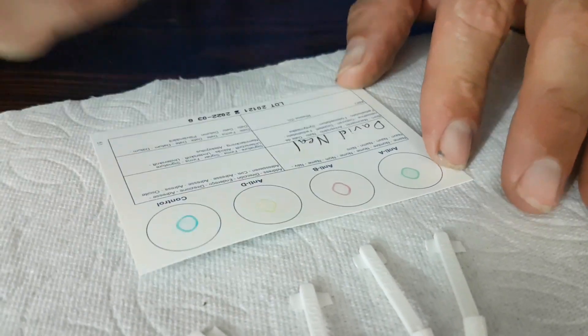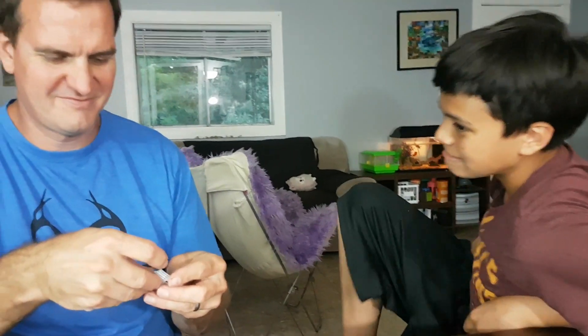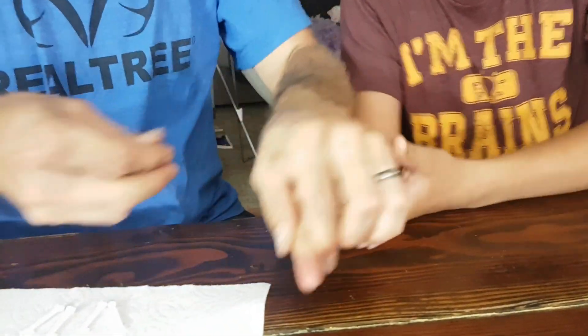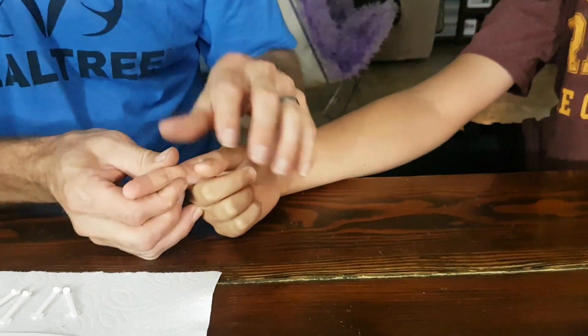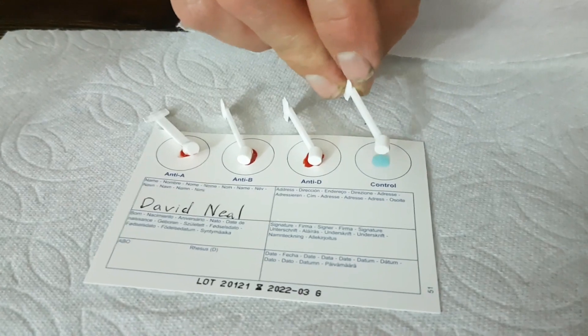Next up is David. David's a little hesitant about this whole process. Give me your finger, David. I can't — I can see the needle. You're okay, it's a tiny little thing, you're all right. Yes, that wasn't so bad, was it? And that's the last one for David.